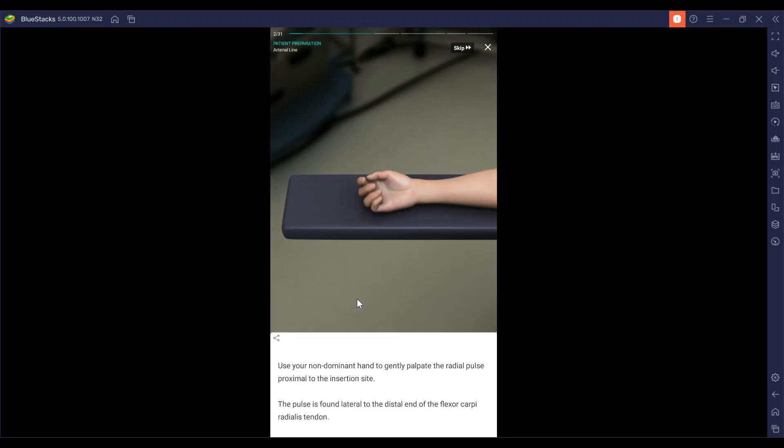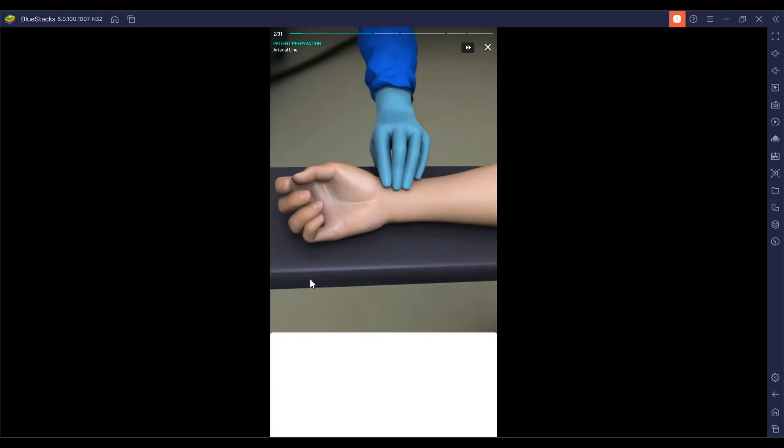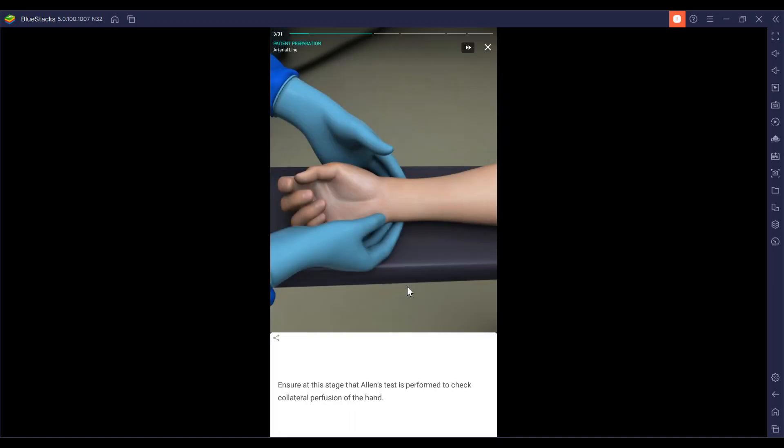Then using your non-dominant hand, you're going to palpate the radial pulse proximal to the insertion site. It's usually found lateral to the distal end of the flexor carpi radialis tendon. Now we're going to check for collateral perfusion of the hand with Allen's test.